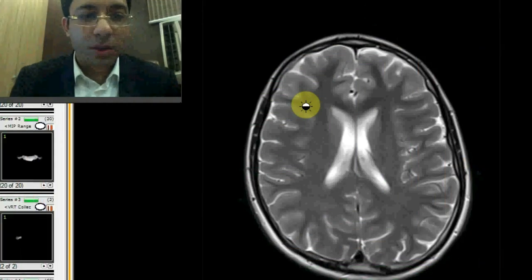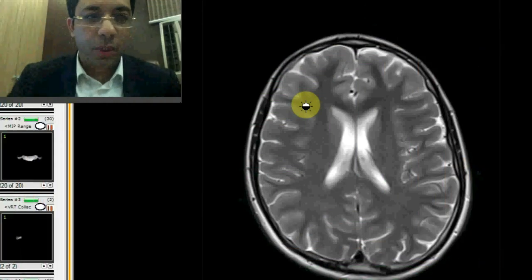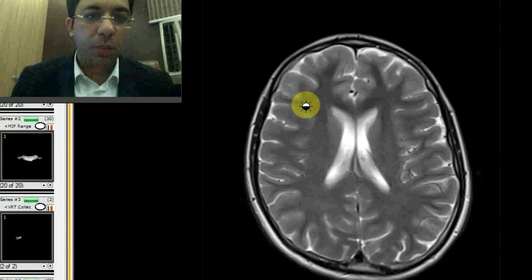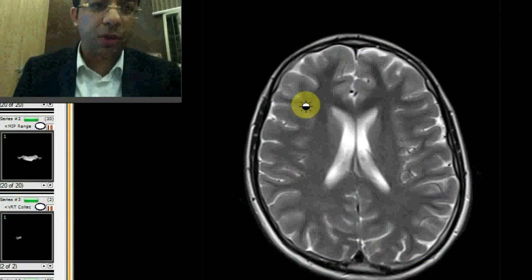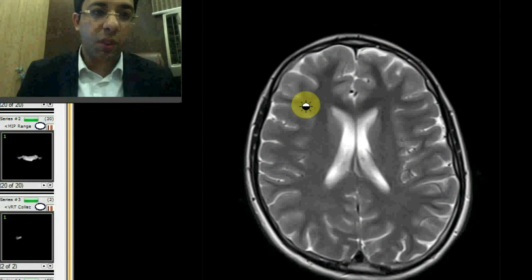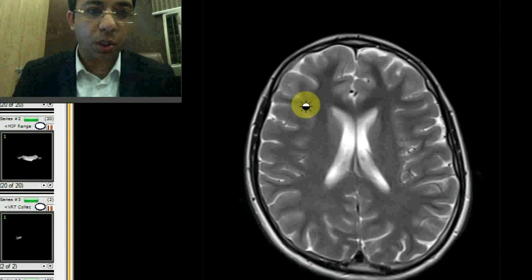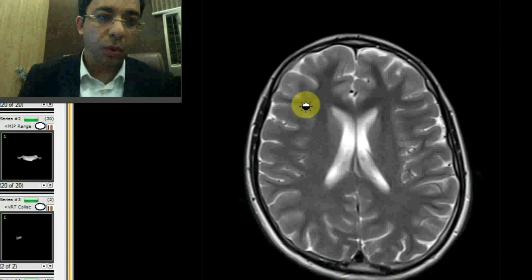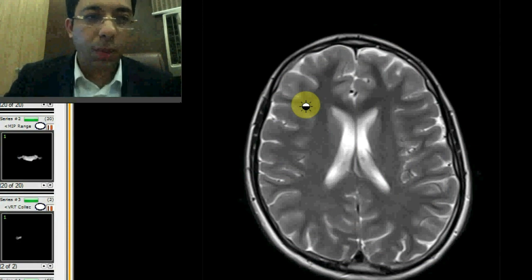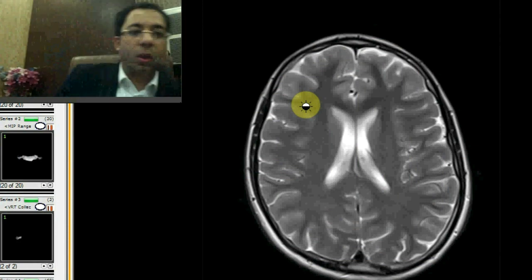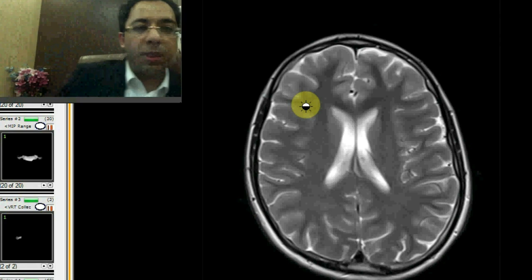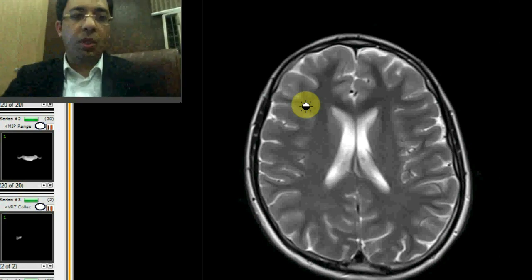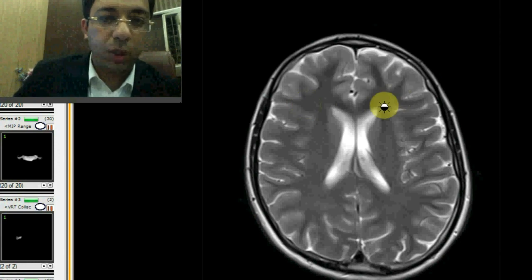Hello everyone, today we will discuss how to look at an MRI brain and what we actually mean by terminology like T1 weighted and T2 weighted — what do they actually look like. What I'll do today is share with you a normal MRI image and show you what we see on a computer when we are looking at an MRI image.